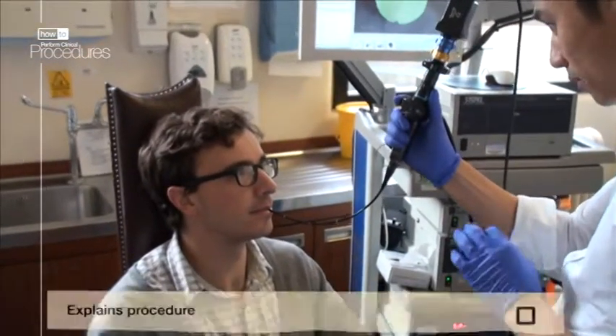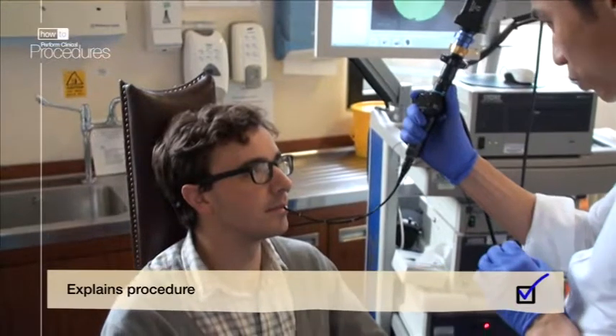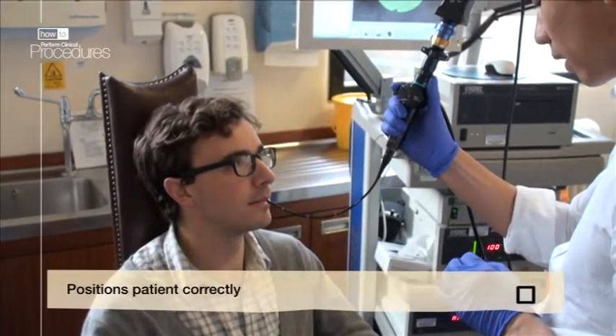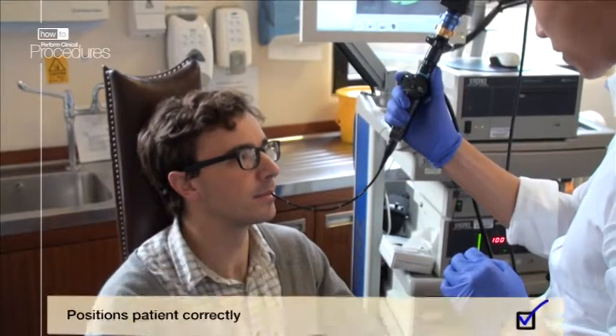It is good practice to fully explain to the patient what you're going to do before and during the procedure. Ask your patient to sit upright and rest their head back against the chair.